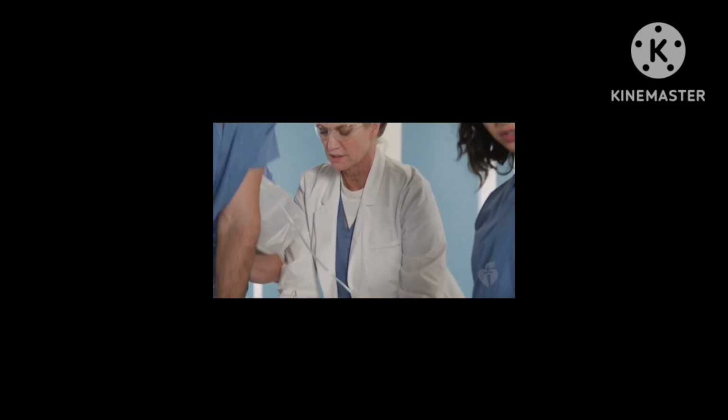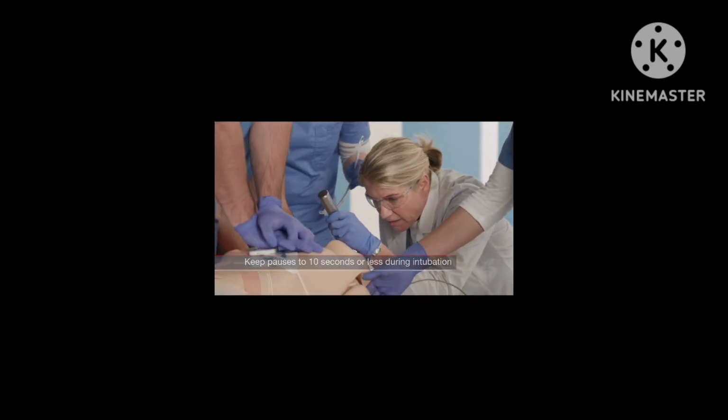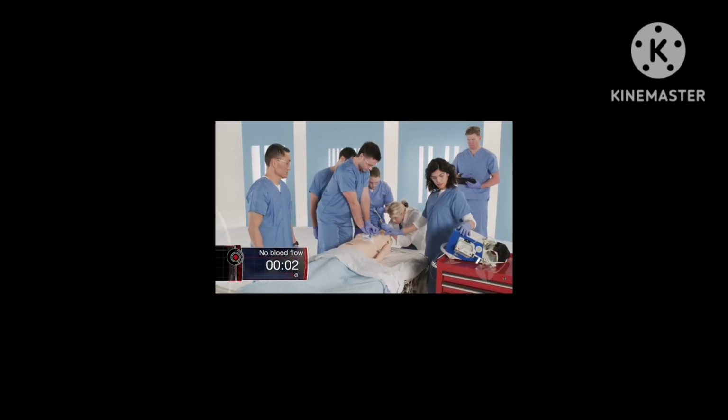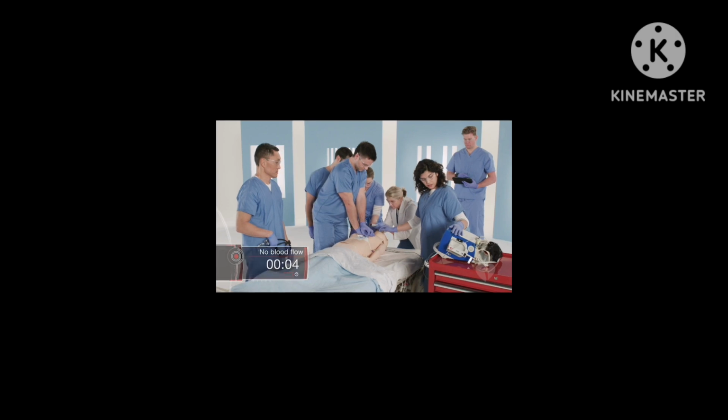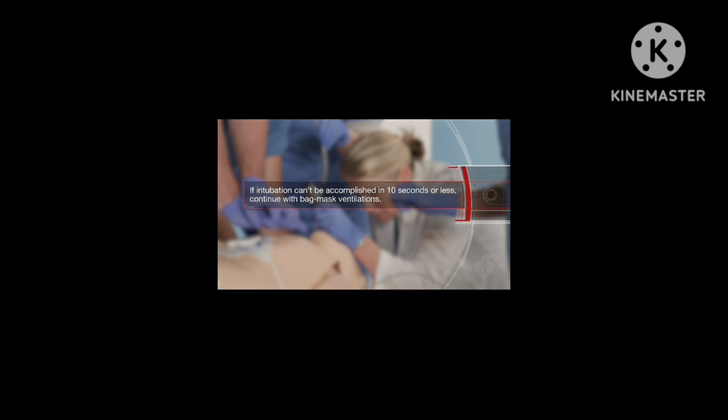Okay, through the cords. But if it's necessary to pause for intubation, the pause must be for 10 seconds or less. I'm still having trouble. Go ahead and pause CPR. Okay, there we go. Through the cords. Continue. If intubation can't be accomplished in 10 seconds or less, the team should continue compressions with bag mask ventilation.